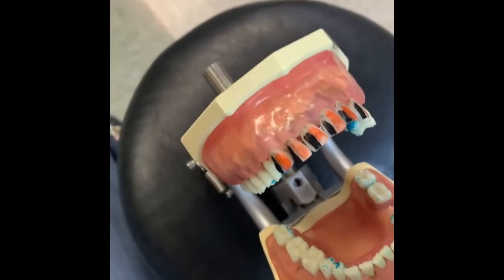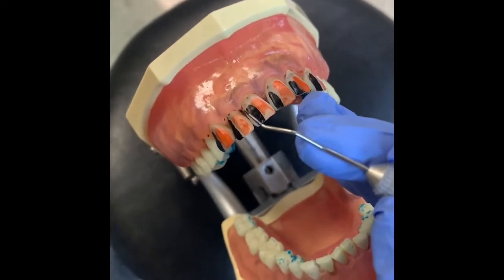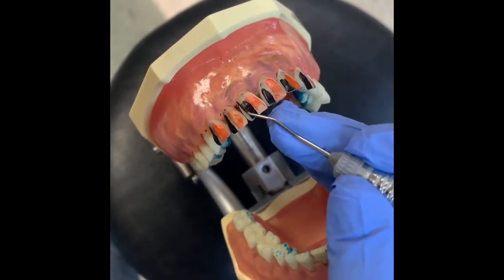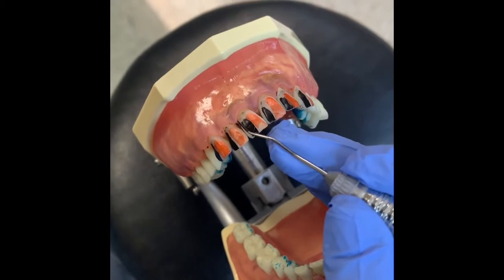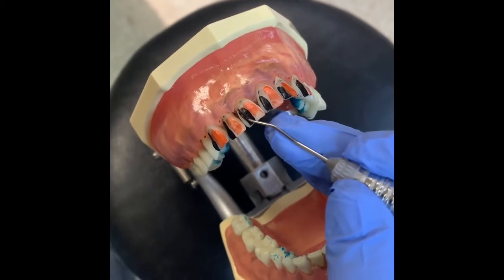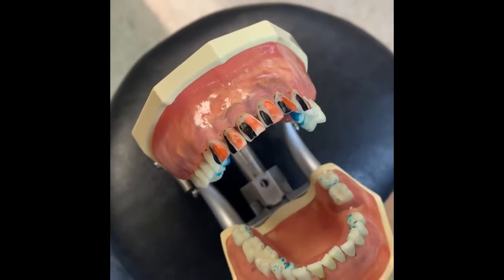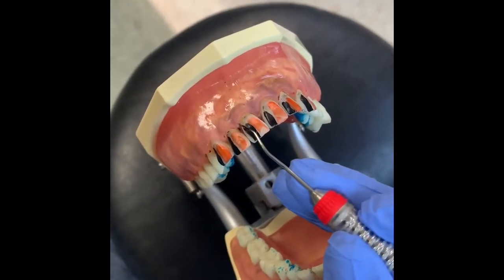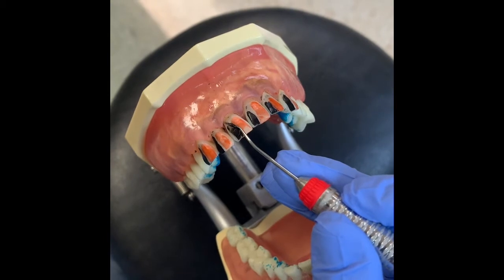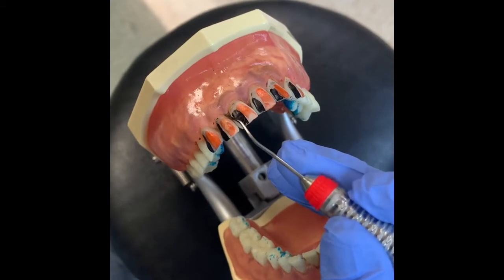Now, I know in the previous video and what I've been telling you with the other instruments is that when you are exploring or when you're using your instruments, we always want the terminal shank to be up and over. So if we're looking at the anterior, this would be up and over. However, we are going to be doing anteriors across, which means that our terminal shank is going to cross the tooth. So right now, if you look at my terminal shank, it's parallel to my tooth. But if I turn the instrument over, you see the terminal shank is crossing the middle of the tooth, okay? So this is anteriors across. This is the correct end for the surfaces towards me. So now this is the correct end of the instrument.